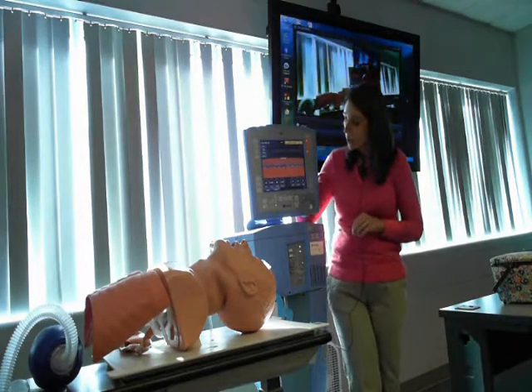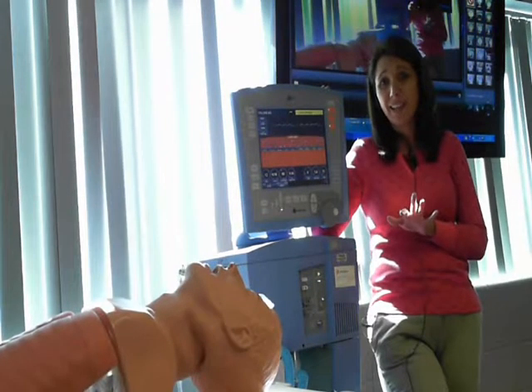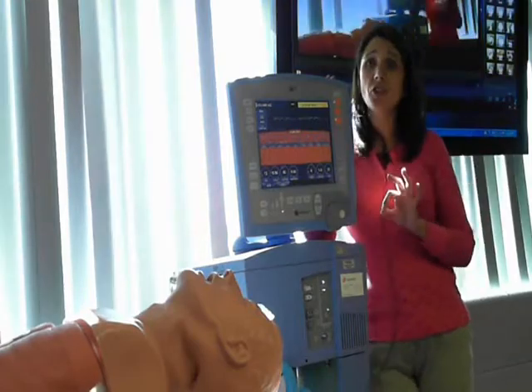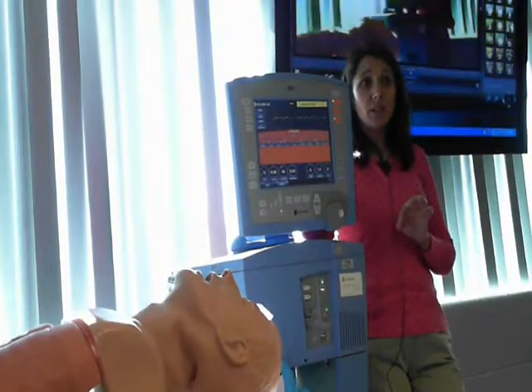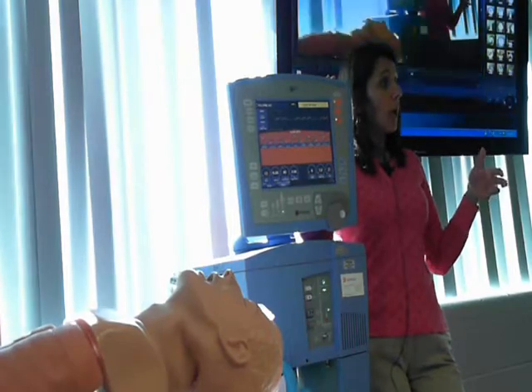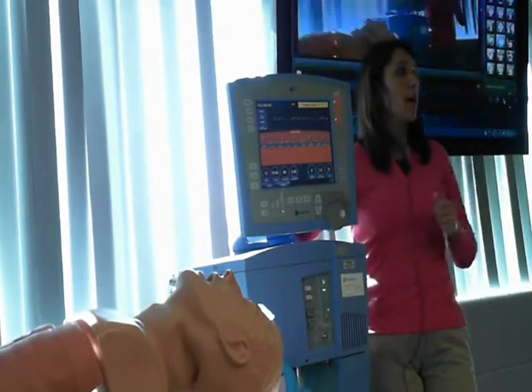Okay? So to get you started, any time that a patient is on mechanical ventilation, as far as just basic mechanical ventilation, you are always going to have the following settings. You're always going to have a tidal volume. Normal tidal volumes will range quite greatly depending on the age and the height of your patient. I don't know if you're aware, but we do not ventilate patients based on their body weight. Our lungs match what should be our ideal body weight, which is based upon our height. So the shorter we are, generally the smaller our tidal volume will be. The taller we are, the greater the tidal volume.